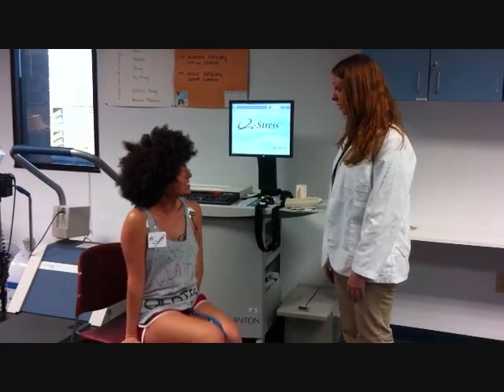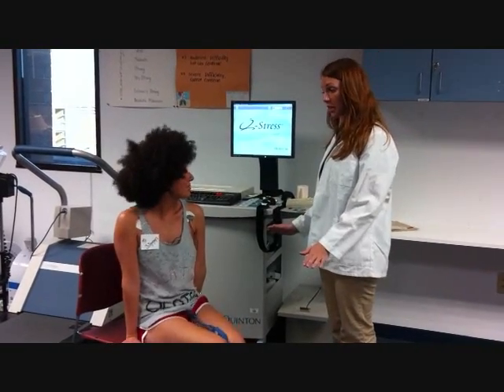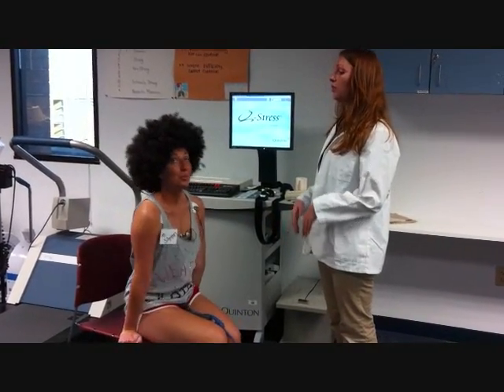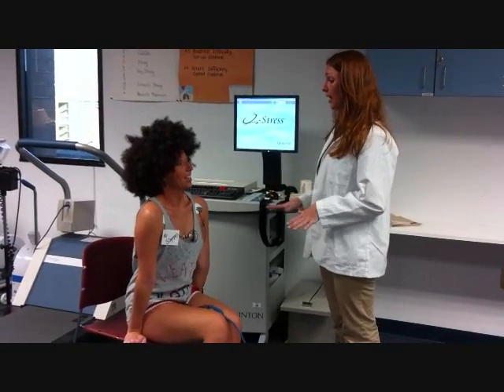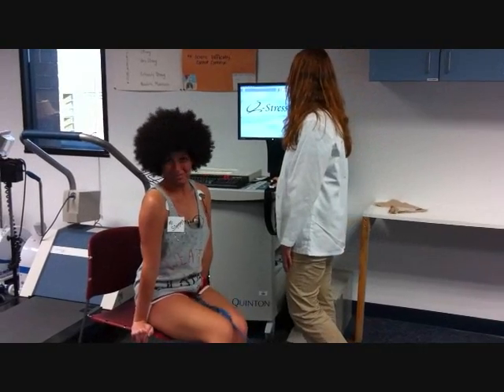Alright, so now that we have your limb leads in place, we need to get a measurement of your resting heart rate. So I need you to sit still for just a few minutes so we can see what your EKG looks like during rest. Okay? Alright, that's it.